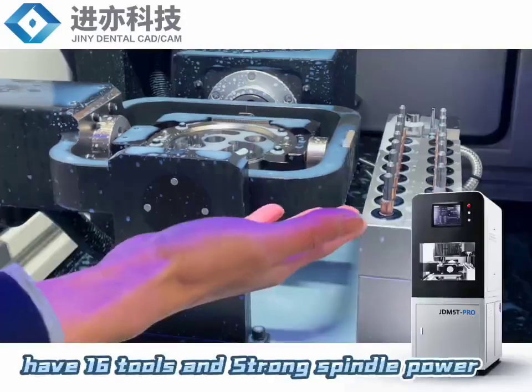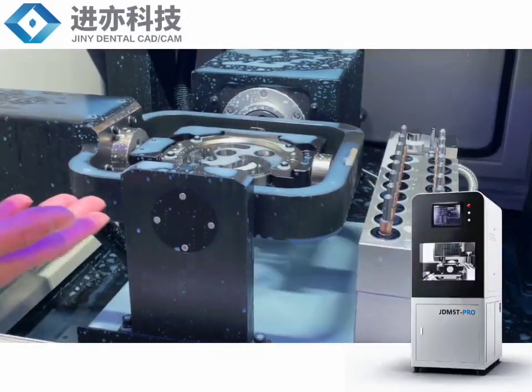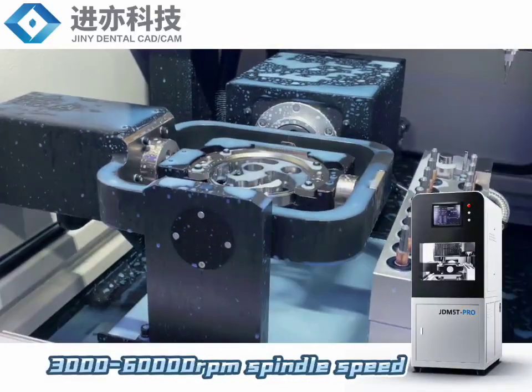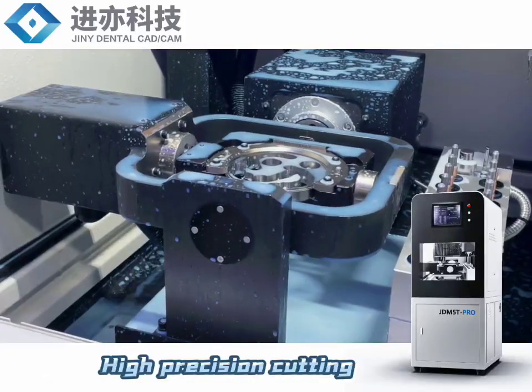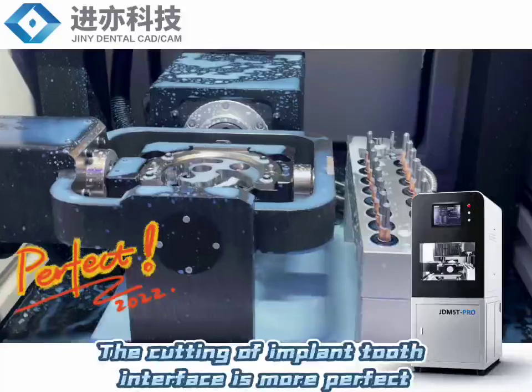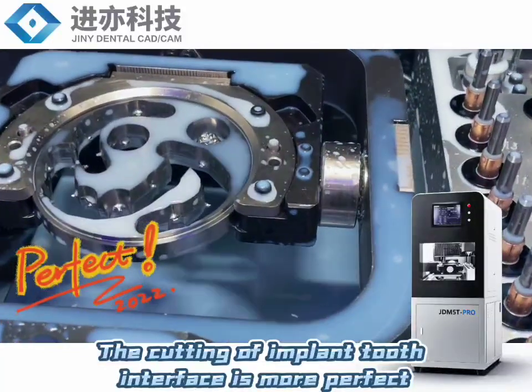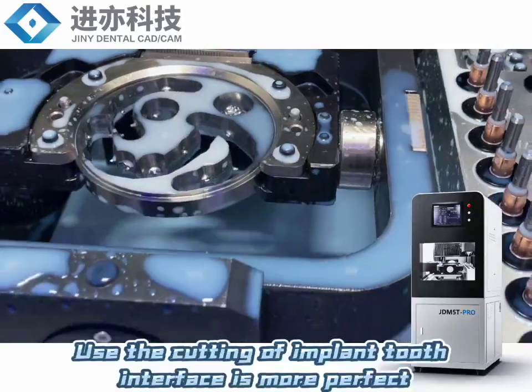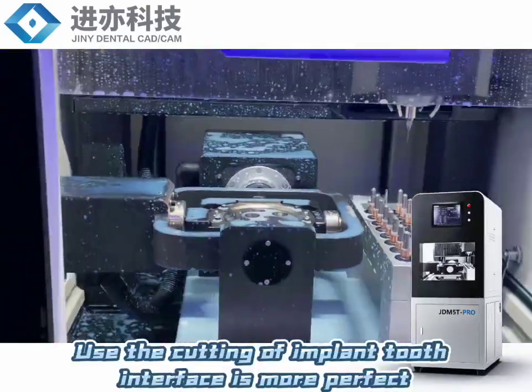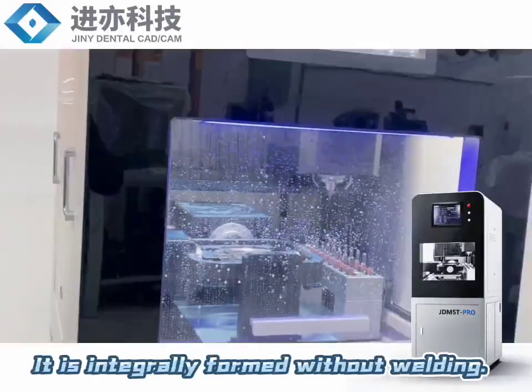It has 16 tools and strong spindle power, double support, 3000 to 60,000 RPM spindle speed, high precision cutting. The cutting of the implant tooth interface is more perfect. It is integrally formed without welding.